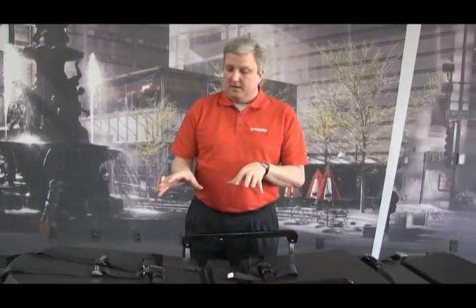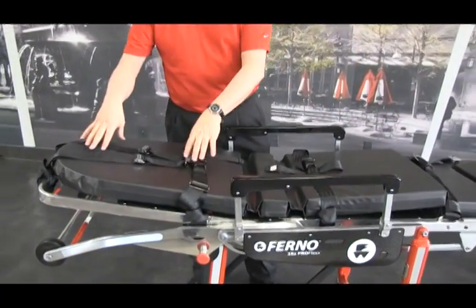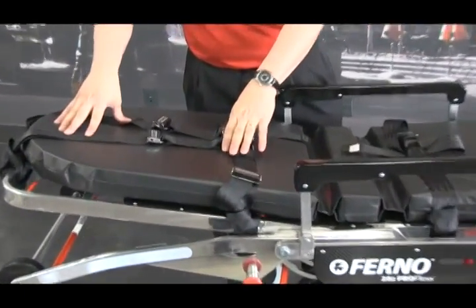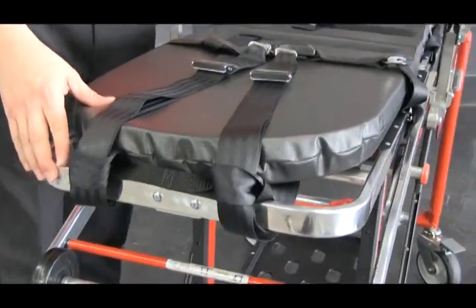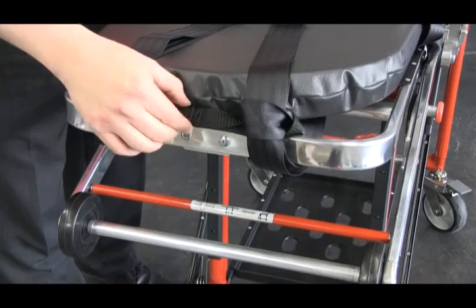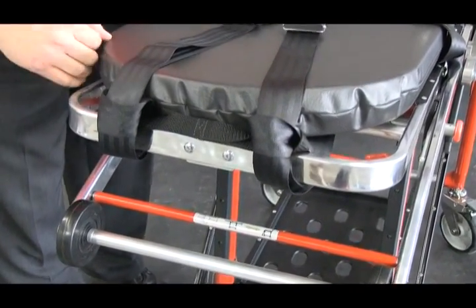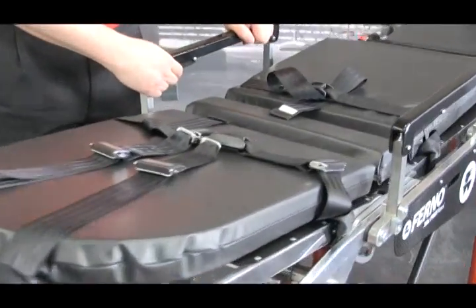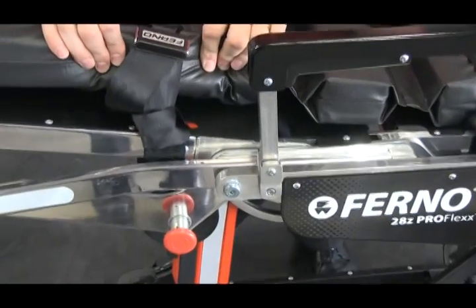The 28Z has three different sets of restraints. On the shoulder area, you have the Mile 417-1 shoulder restraint. On the top of the shoulder restraint, you have the figure-8 restraint, which allows the shoulder restraints to stay together and not come apart around the patient.